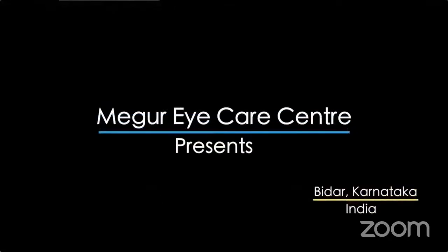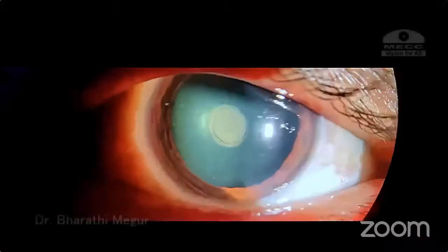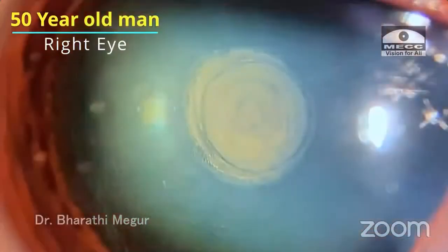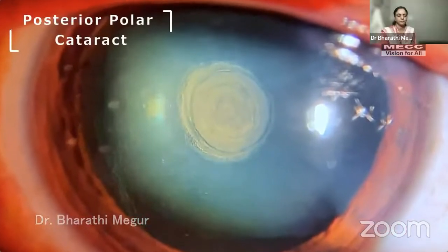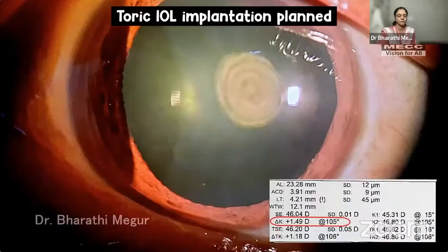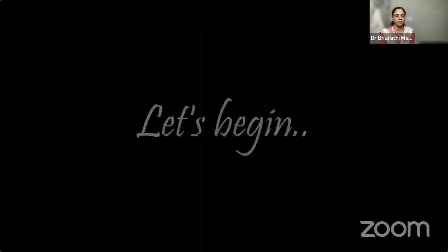Good evening, ma'am. This is the right eye of a 50-year-old gentleman. We can clearly see the typical onion ring appearance of a posterior polar cataract. This patient is scheduled for a toric lens implantation.